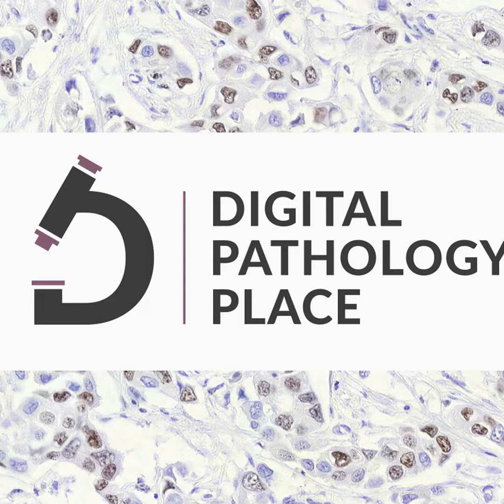So looking at the FDA, all of the FDA cleared whole slide imaging systems are showing very similar performance in the validation studies.